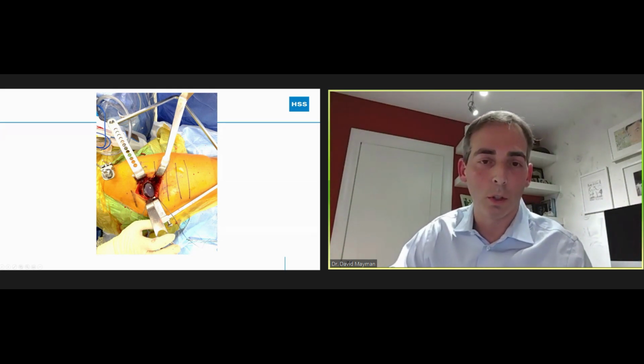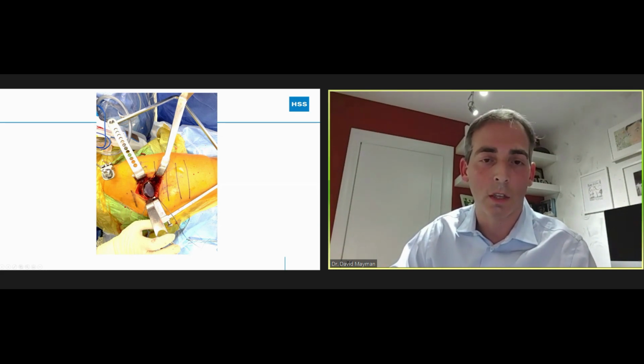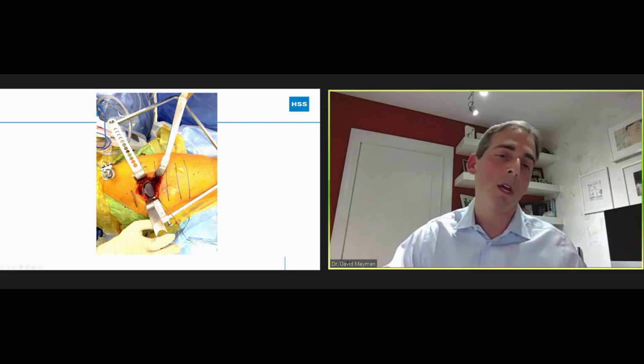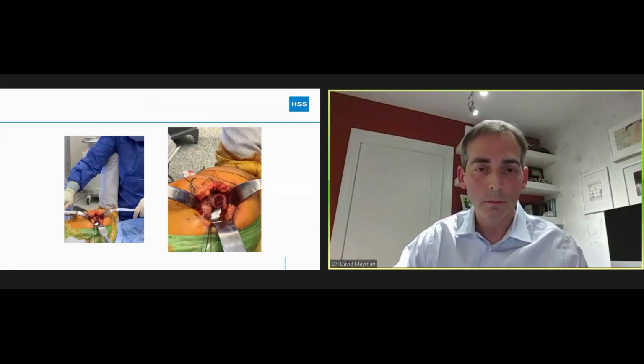Okay, and then I think it's always important, again, we're surgeons, you can't just depend on this technology. You need to be able to look at what you're doing. So look at that acetabular component position, again, making sure that the anterior metal part of the acetabular component is tucked under that anterior wall. You're typically going to see a little exposed acetabulum, superior and posterior. You can use your transverse acetabular ligament for guide as well. So you're putting that component in where you think it fits in that patient's pelvis, and then you're checking with the device to make sure that there are going to be no surprises.